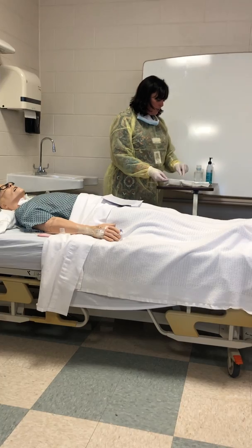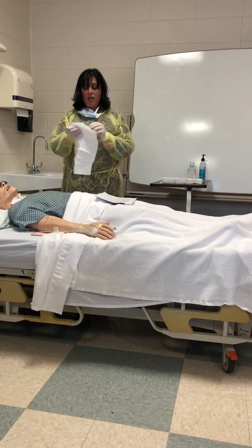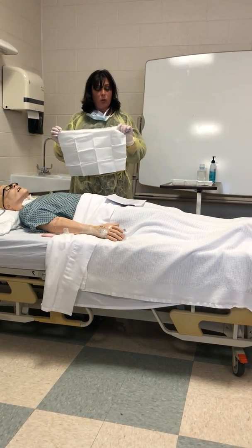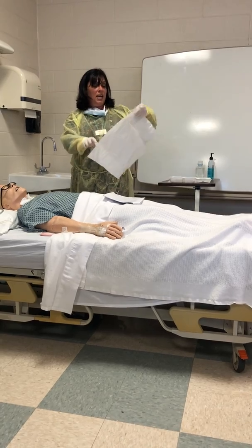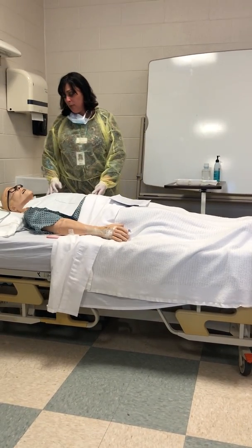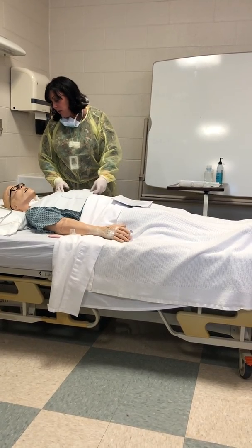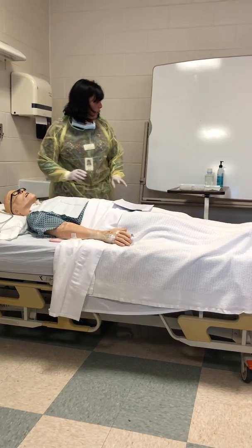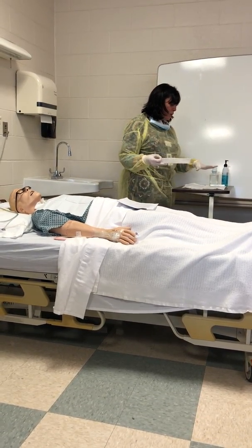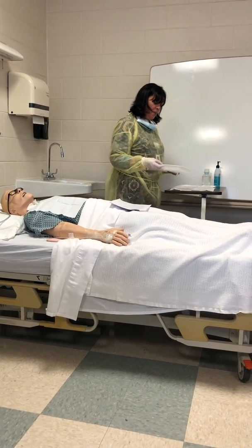So here's some gloves. This little handy dandy feller, I like him a lot. The shiny side is water resistant-ish, and the matte side is absorbent. So I'm going to put it matte side up. And I'm going to do your trach care. He is not excited.